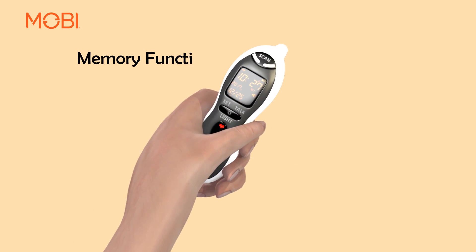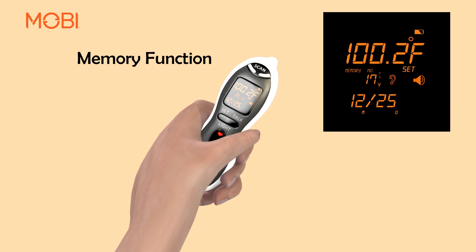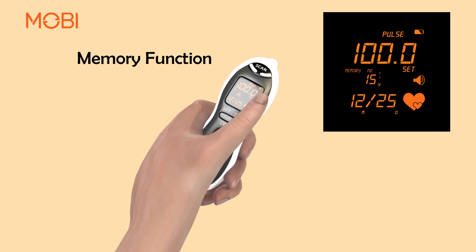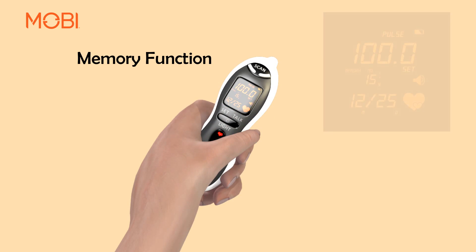Memory: Press the Set button to retrieve the most recent reading recorded in memory. Starting with the highest number, it will show the body temperature, the type of reading whether it was ear or forehead, the fever or no fever colored light, the date it was recorded, and the memory number.